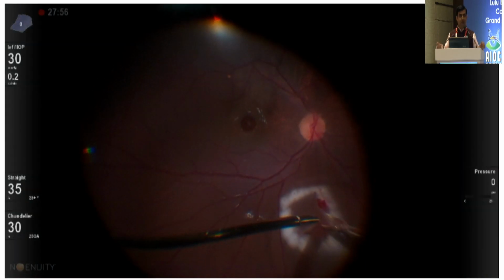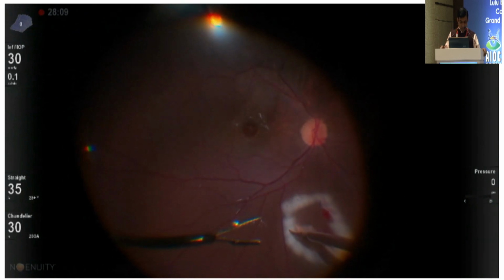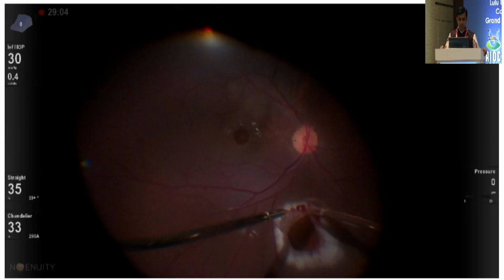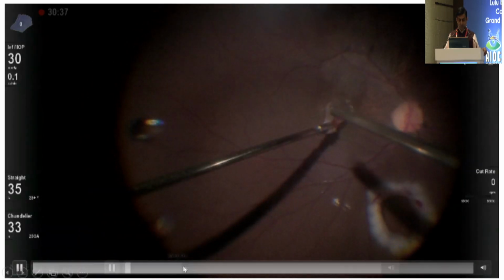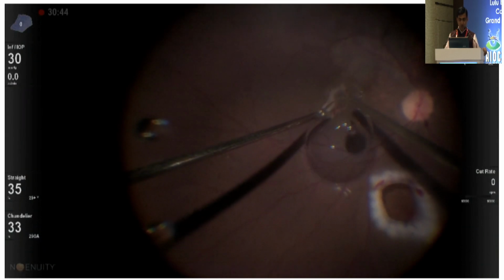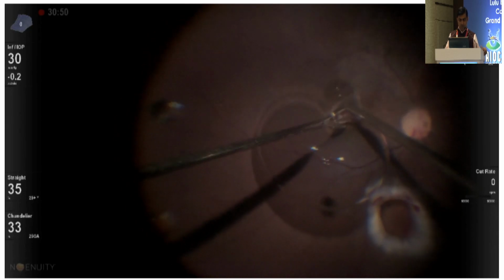That kind of area you have to choose. And again, I injected a 38 gauge needle, tried to create a small blister, and this is also done bimanually. Now you can see I tried placing it and putting a PFO above it, but it slipped and came up.